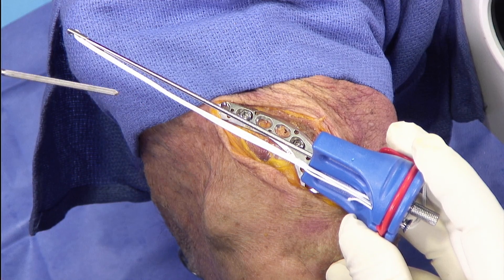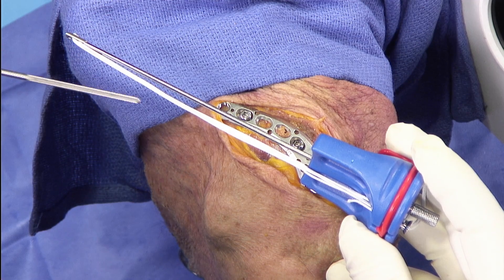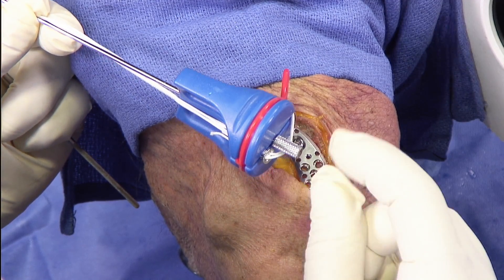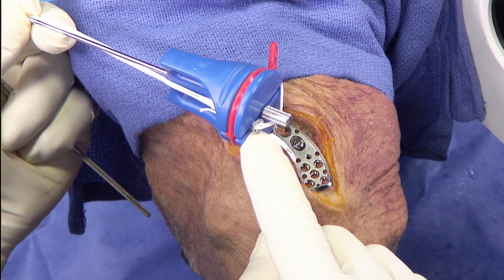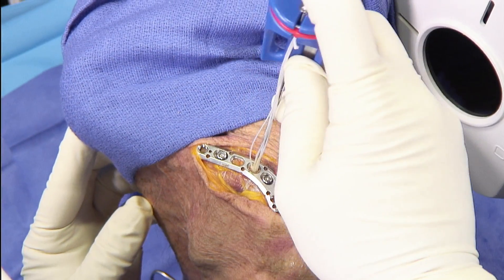Our device is rather simple. Distally we have an angled button with a knotless tightrope woven through it. Up top we have a handle and inserter. The button is held on by a threaded pin. And up top we have our plate button that will nestle into the eyelet of the plate. We're going to start to place our button now.